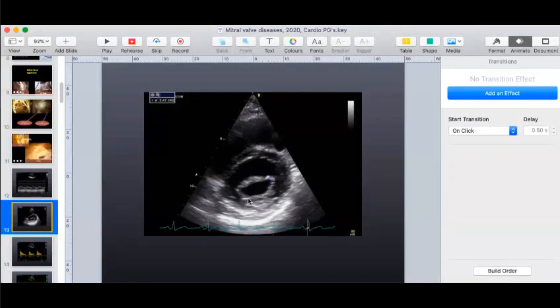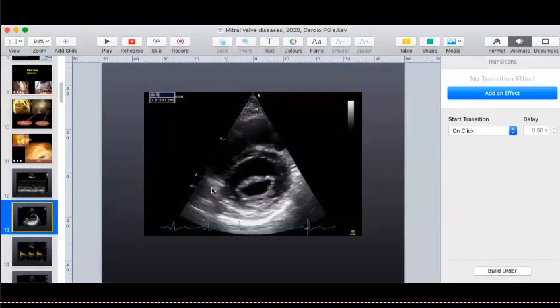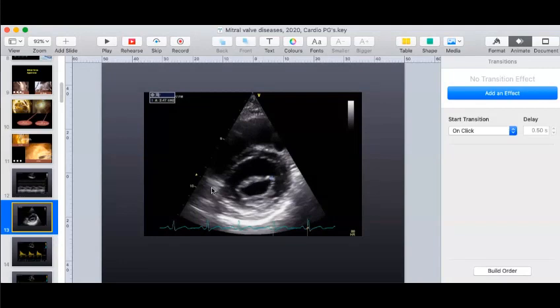So to come to the exact point where you need to get the smallest orifice, which is your objective, you may not get it. You might be oblique and you might be tangential, and that is one fallacy where you can go wrong, and that is why you have these variations.